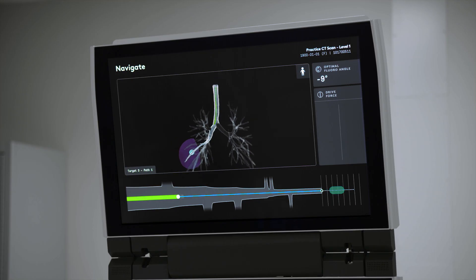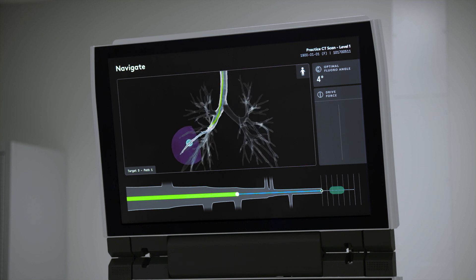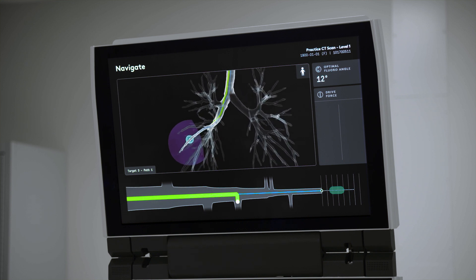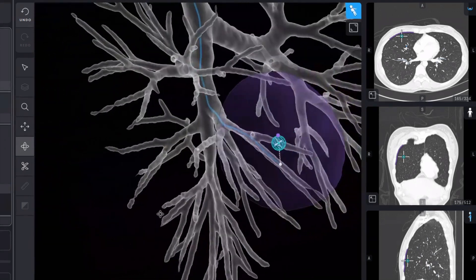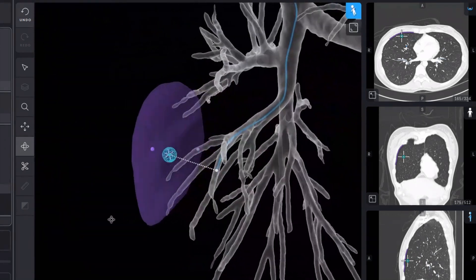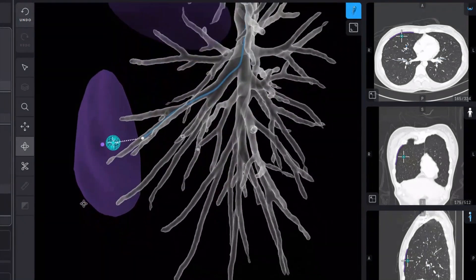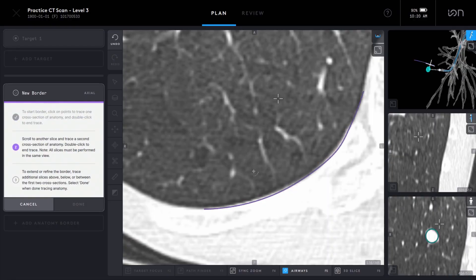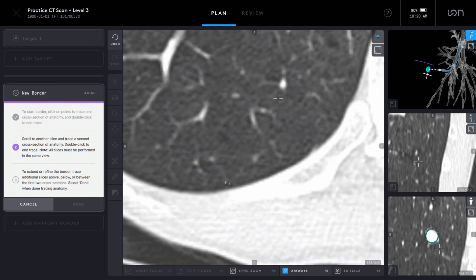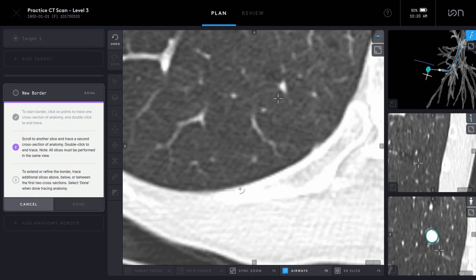The Ion Plan Point software was developed with patient safety first in mind. The Plan Point software provides the user with automatically generated anatomy borders based on the nodule's proximity to the pleura or fissure. It also provides the user with tools to mark additional anatomies of interest, allowing the physician to have a reference to where these structures are while performing their procedure.